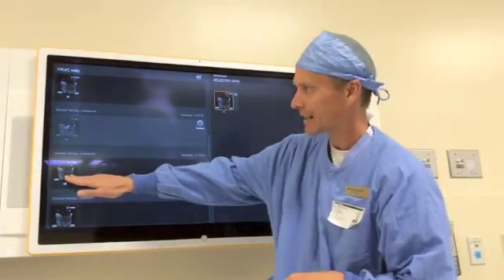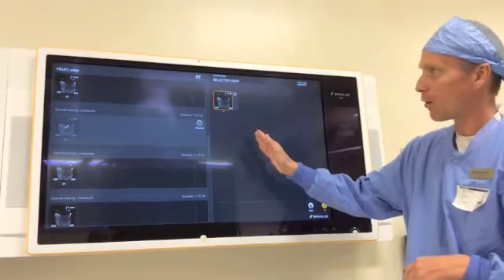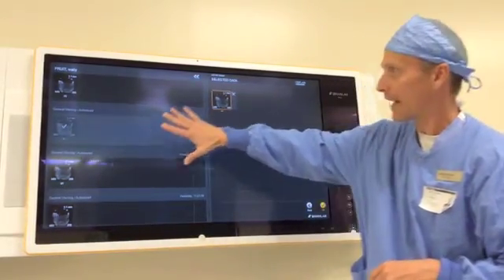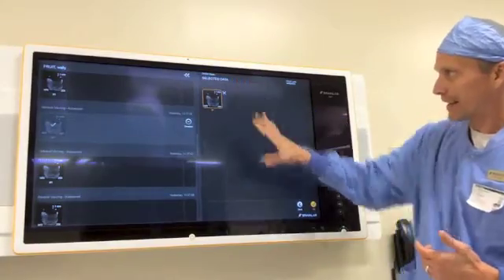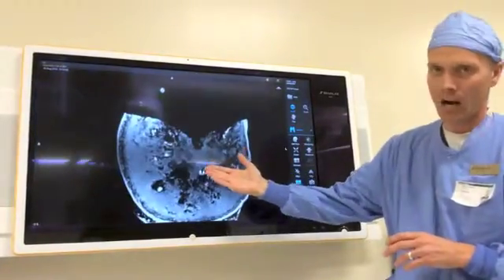What I just did is selected the data set that I want. Once it's selected, it's going to queue up — as we call this, this is your grocery store. Once you select it, it's going to jump over into your cart, so to speak. From here, I've got the data set that I want to view. I just press OK and it launches the DICOM viewer.